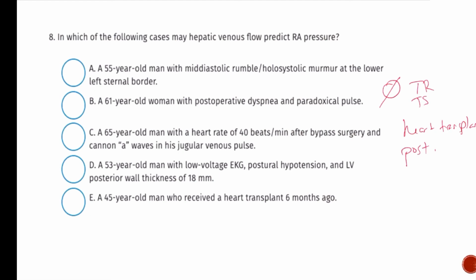You're going to see septal changes. You're going to see things that don't make sense based on your other patients. So again, with these patients, you have to be very careful in your diagnoses of volume status by echo alone. Understanding the physiology in general is really important. We'll talk about those at a later date. So post-op, AV block is going to also cause some trouble.